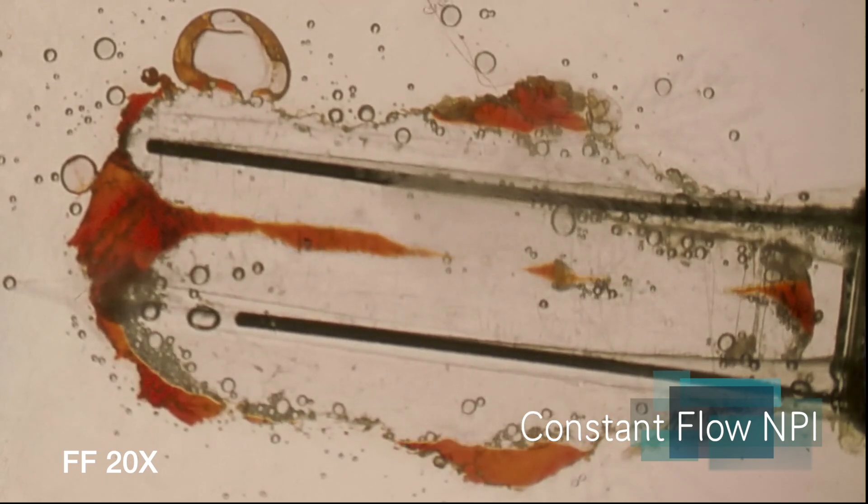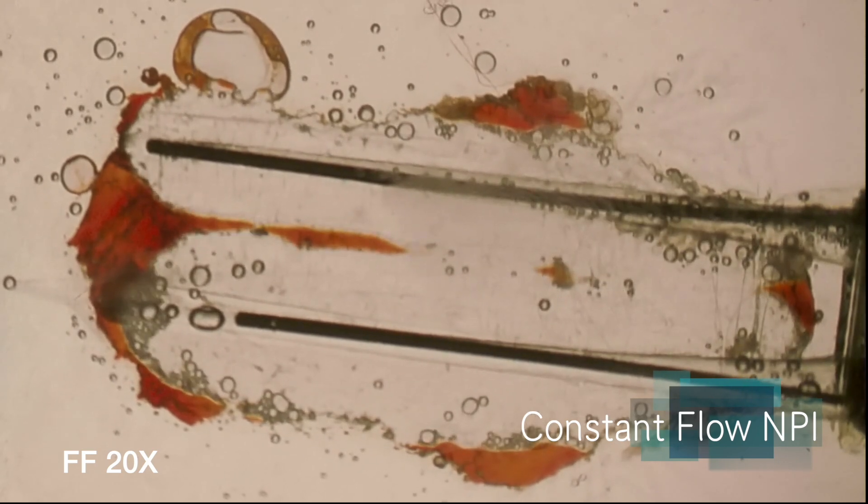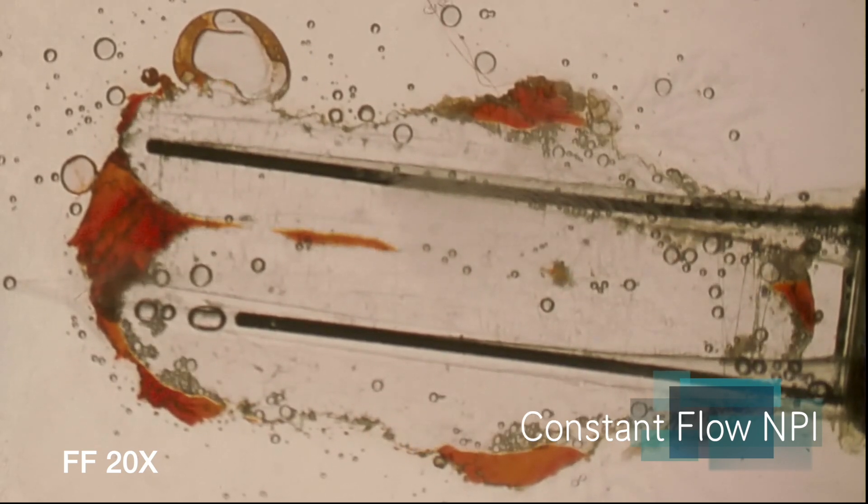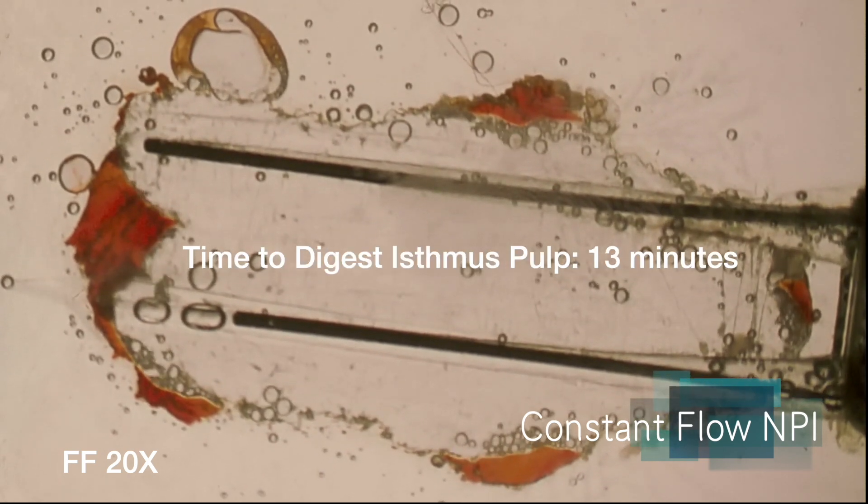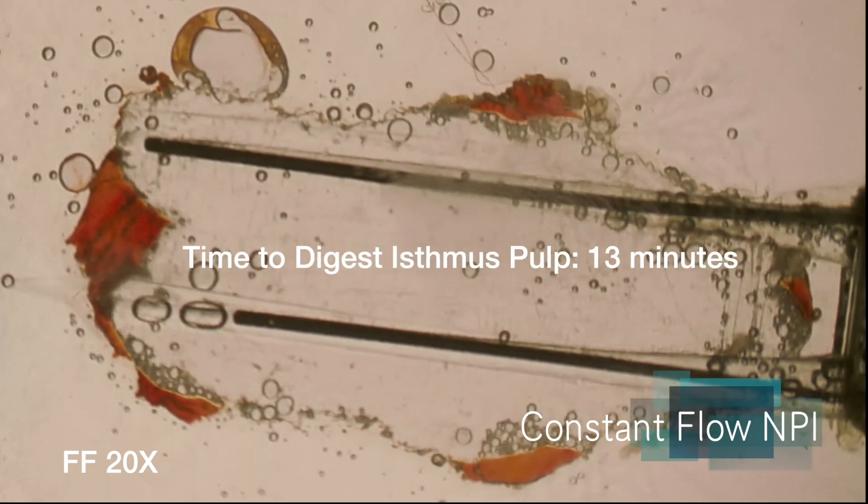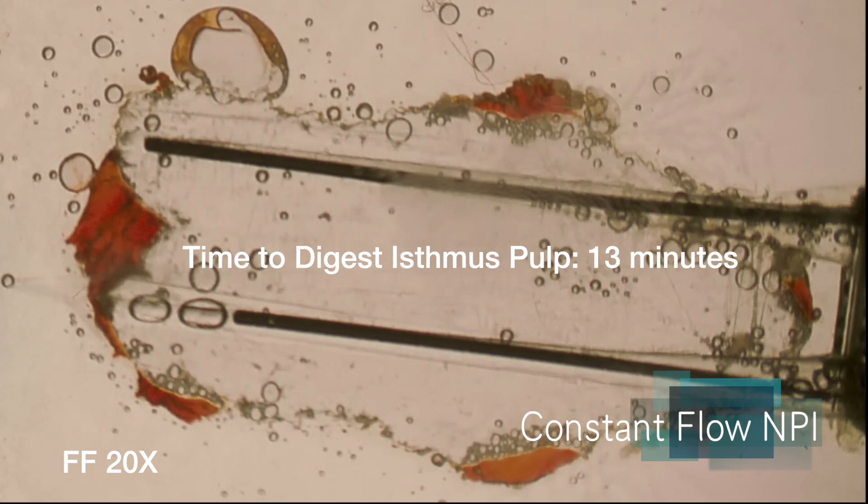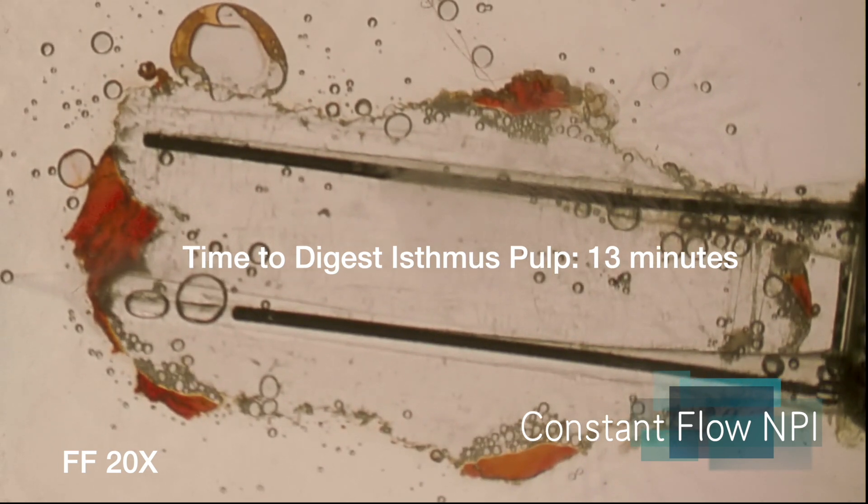This is really amazing. That's at about 5 minutes. And the isthmus is clean in 13 minutes. That's pretty amazing. Look at that. It's just disappearing. It's being dissolved.